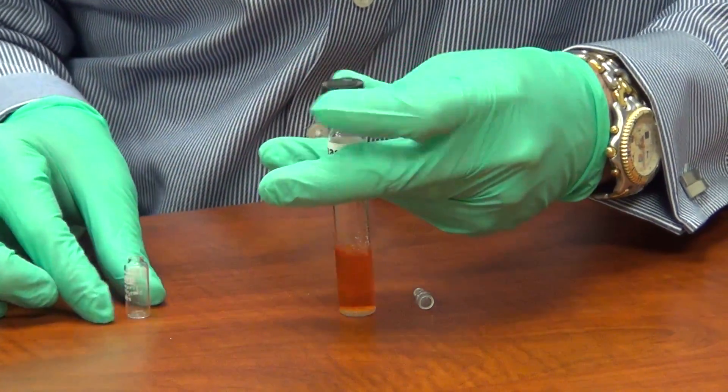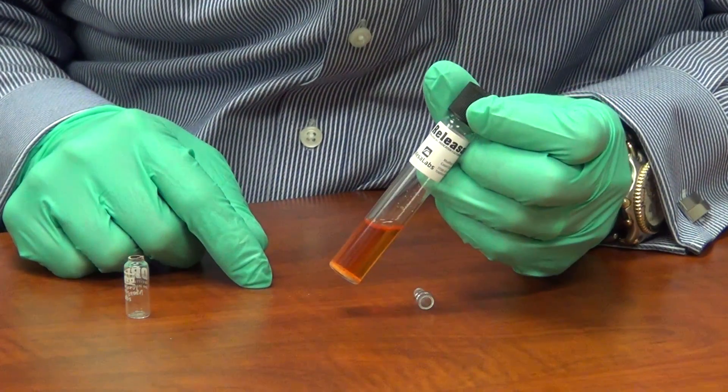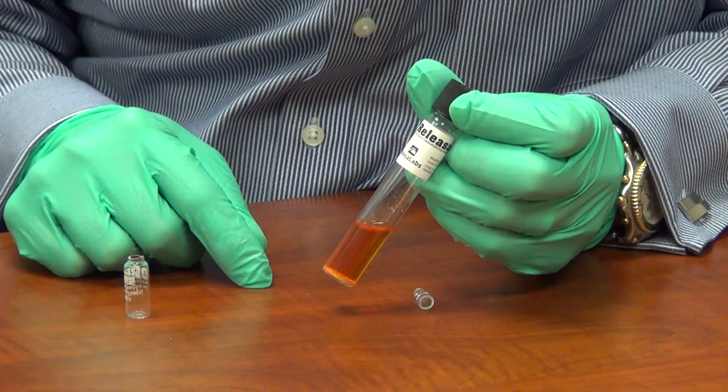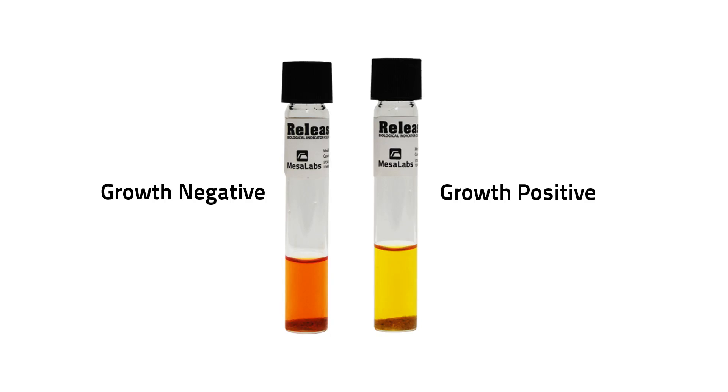The spores are now in contact with their ideal culture medium, and when incubated at 37 degrees centigrade for three days, positive cultures will turn the media from this red-orange color to bright yellow. Here you can see what a growth positive test result will look like. The tube on the right has turned yellow, which is indicative of microbial growth. The tube on the left has retained its original red-orange color and is growth negative.